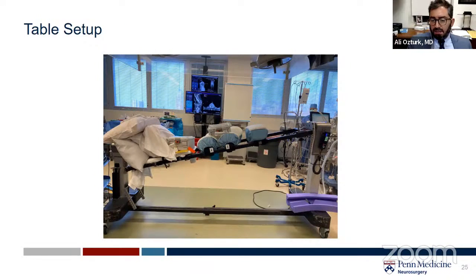These cases are uncomfortable cases for the surgeon because of the patient's deformity. The patient's head in this situation would be going straight down many times in a fixed angle. Maximize the reverse Trendelenburg on the OR table as we've done here. And a pearl that we found that's quite helpful is to switch sides with your co-surgeon or your assistant, resident or fellow. It eases some of the pain on the surgeon's back quite a lot. I'm a big believer that a comfortable surgeon is a safe surgeon.